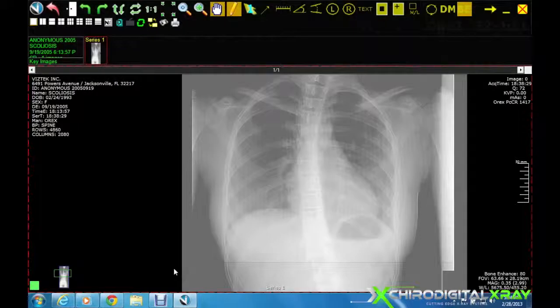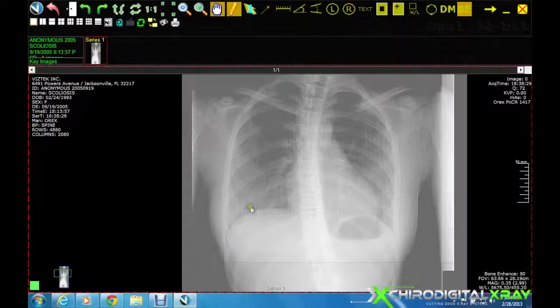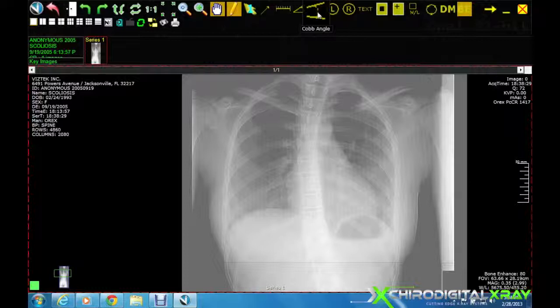The Cobb's Angle tool allows us to measure the angle of a scoliosis in a given region of a patient's spine. To draw a Cobb's Angle, click on the Cobb's Angle tool on the main toolbar.